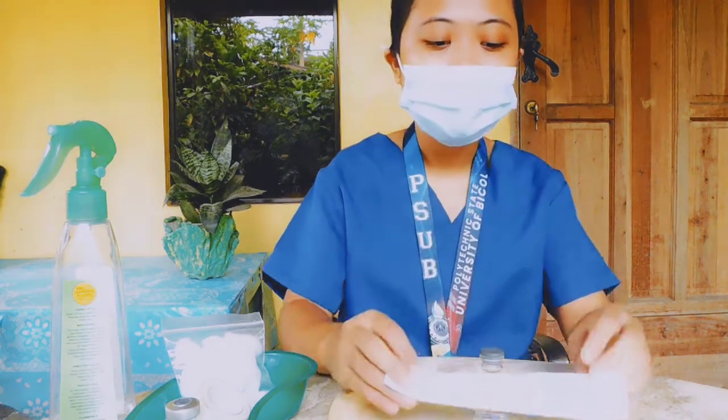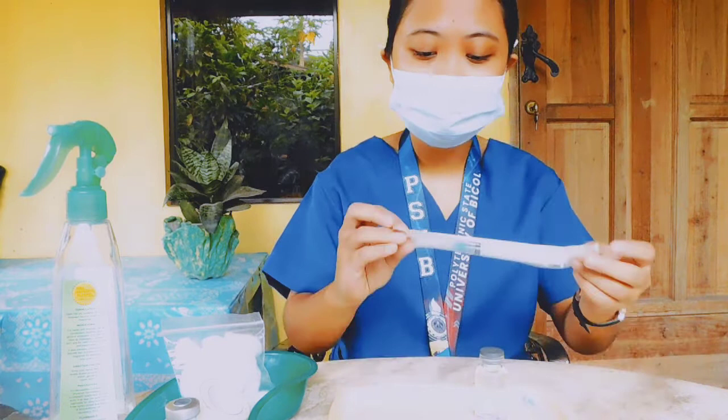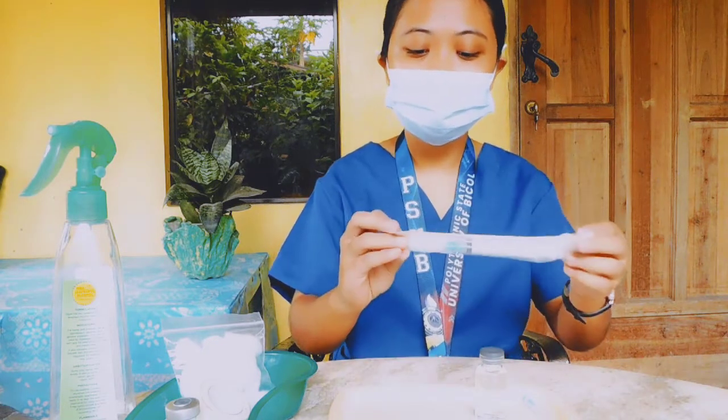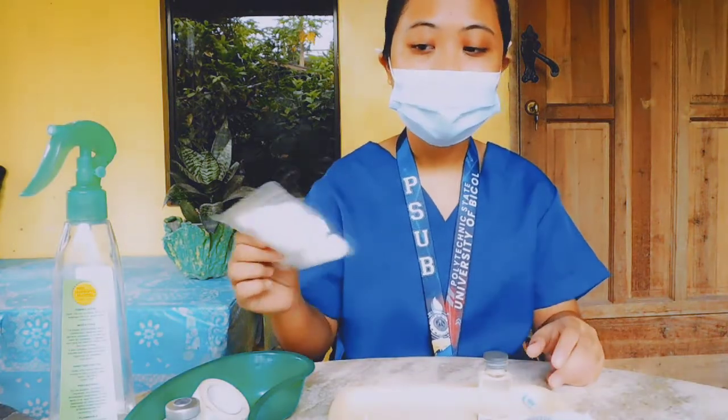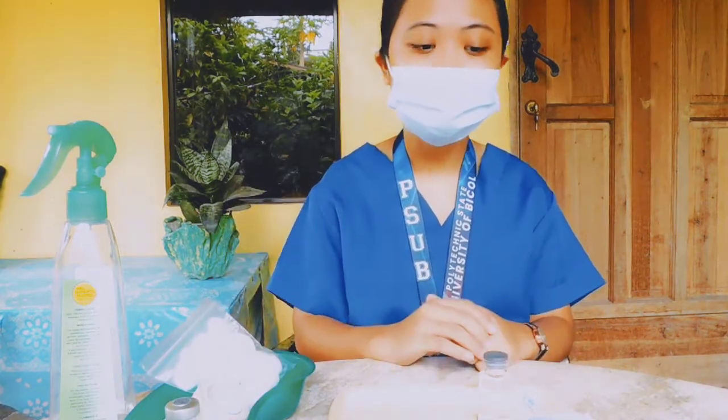The equipment that I'm going to use, of course, do not forget to bring the MAR or the printout, and then our sterile medication here. Since it is only 1 to 2 ml, I'll be using the 3 cc syringe, and then it has this 23 gauge needle here. And do not forget to bring the antiseptic swabs and clean gloves according to the agency protocol.